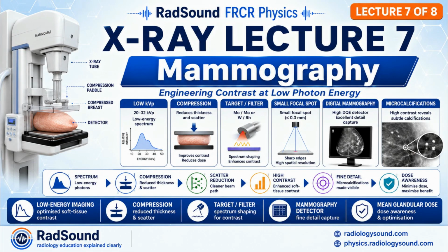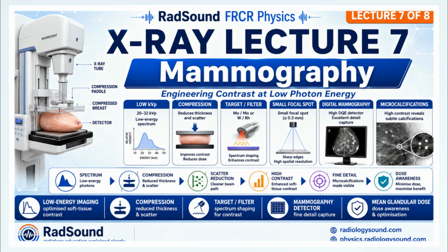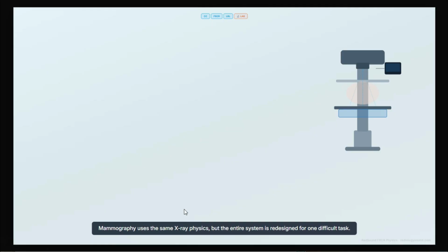This is lecture 7 in the X-ray series, which is mammography. We will cover the mammography tube, target, and filtration. Let us dive into it.